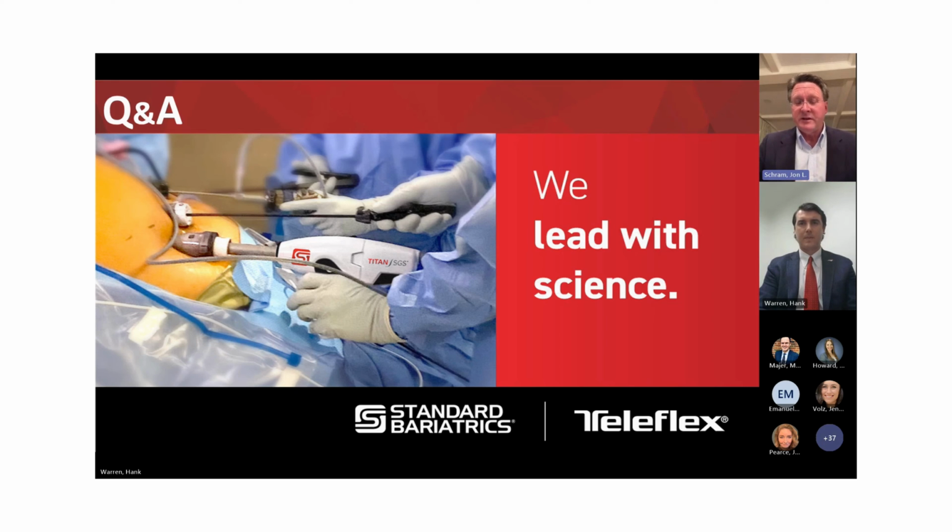The beauty of this bougie with the balloon, which we can stick right at that incisura, it's about 3 or 3.5 inches long, and we place that right at the incisura, and that takes it up from a 38 French to about a 42, 44 French. And having that right at the incisura just gives you a world of comfort that you can't get too tight at the incisura. And we haven't had, in now over 2 years, a single stricture at the incisura with 1,700 cases now. So it's spectacular for us.